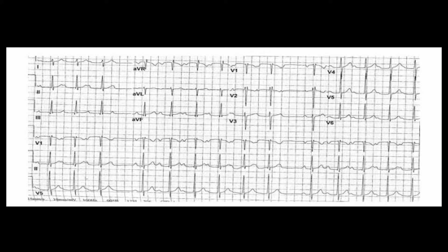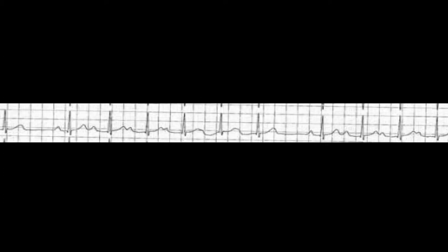In this ECG, the RR interval appears irregular, the QRS is narrow and under three squares, and the axis is normal with lead one and AVF both positive. The difficulty here is finding your P waves. It is a good idea to find two clear P waves and then work backwards and forwards to identify the others. Looking at the enlarged rhythm strip: the PR interval is normal on the first beat, but on the next beat it has extended, and continuing that pattern the PR interval continues to extend. Later in that cycle, the P wave is hidden within the T wave.